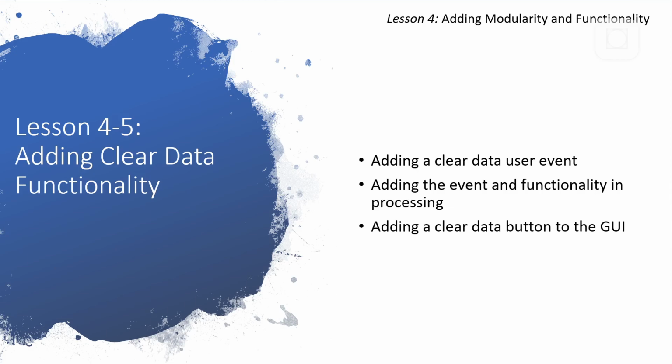The reason we want this is to be able to clear the data without having to wait the full length of our waveform size. Sometimes maybe we want the waveform size to become up to a minute, and without being able to clear the data, we would have to wait that whole minute before doing something or restarting the application. But now we can just clear it and we know it will start from the beginning again.